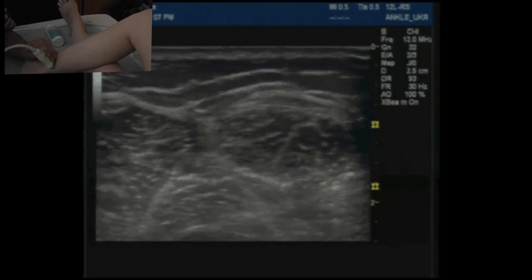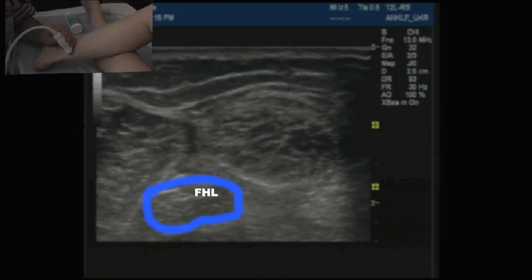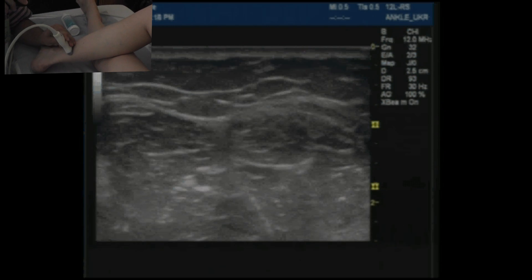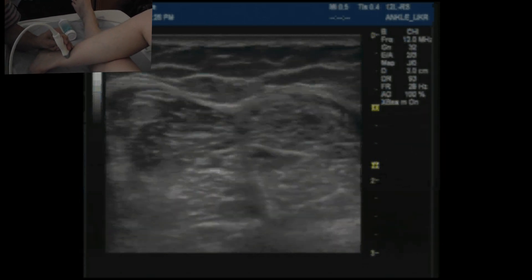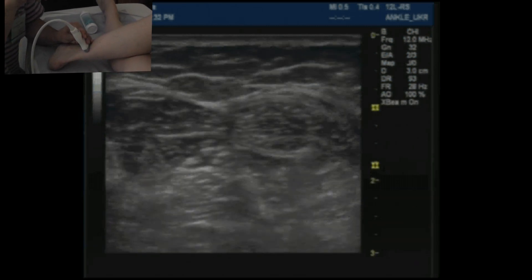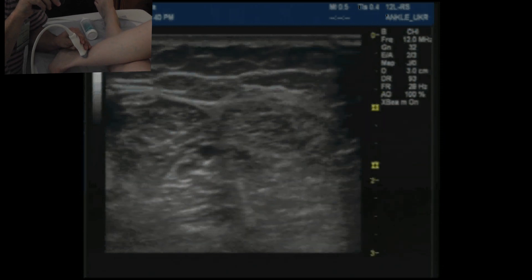If we move a little bit more posteriorly, we can see another muscle here — this is soleus — and part of the Achilles tendon here. And that means that the muscle deep here is flexor hallucis longus. Around the vessels here, we can see the tibial nerve. If I ease off from the pressure, you can see two accompanying vessels.